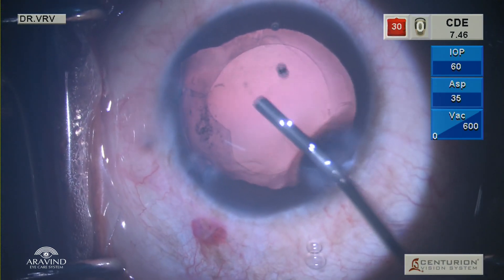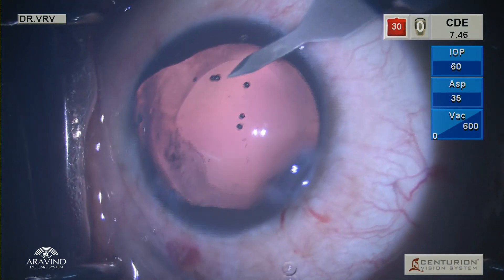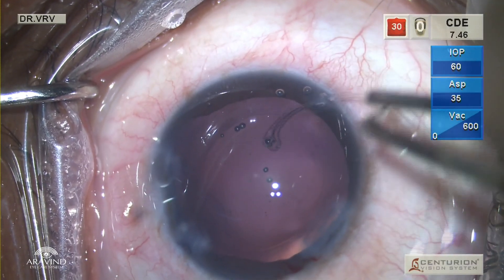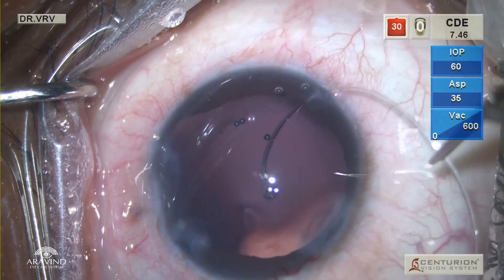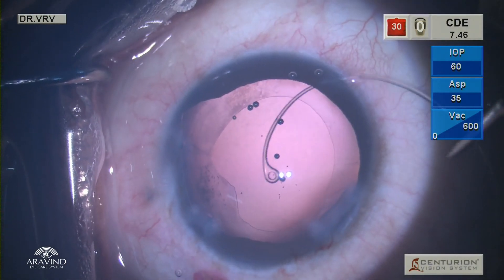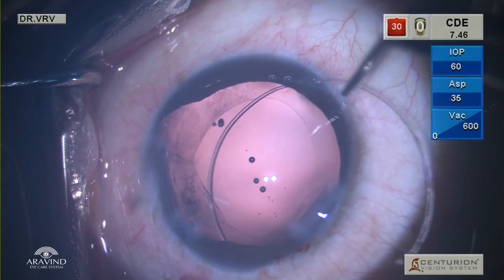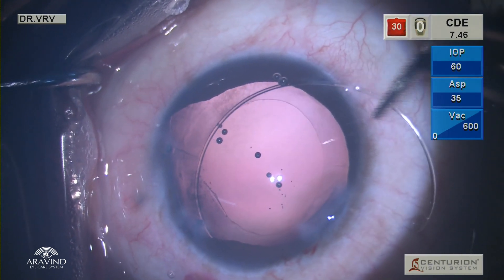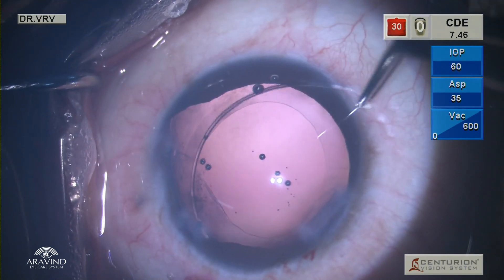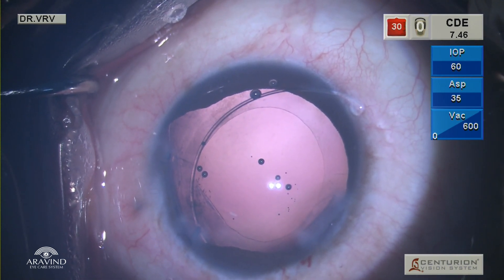The anterior chamber is filled with HPMC and then a superior 1 mm paracentesis is made to facilitate CTR insertion. The CTR is held at one-third distance from the leading eyelet so as to have proper control while introducing the CTR. The leading eyelet is pointed vertically downwards so that it goes into the bag clearly. When you try to place the CTR in a horizontal manner, sometimes you can lose it into the sulcus area. So make sure to keep your eyes focused on the rhexis margin and the leading eyelet. Once the leading eyelet goes below the rhexis margin, it is easier to railroad the remaining part of the CTR into the bag.